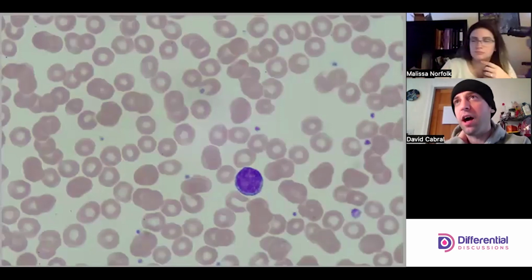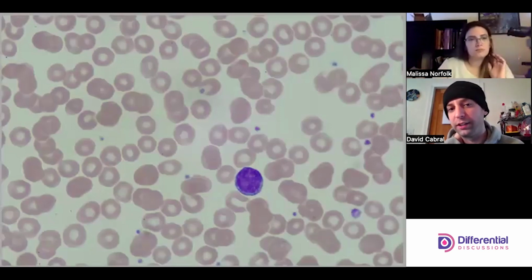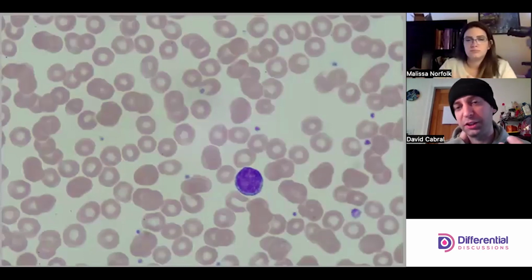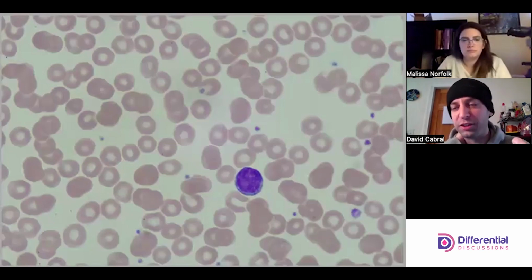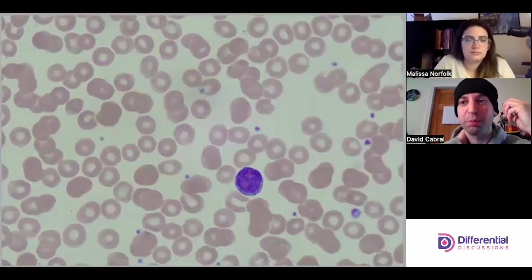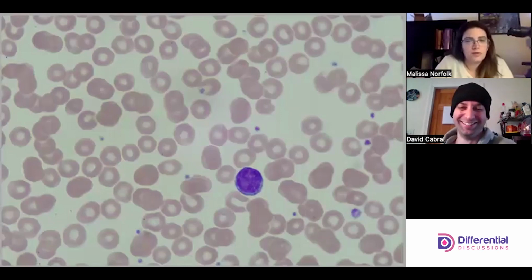Yeah. And to be honest, if I have a student that's overcalling things like this, it's not a terribly large problem. And I'm actually, for the most part, comfortable, right? And so when I'm doing an assessment and I'm grading, I'm going to take points off, right? But I like what the student's seeing, if that makes sense. And what we need to do is just train that uniformity between techs. That's the last piece of the puzzle. So I would appreciate that you see those features, but you need to follow procedure. Yeah. All right.